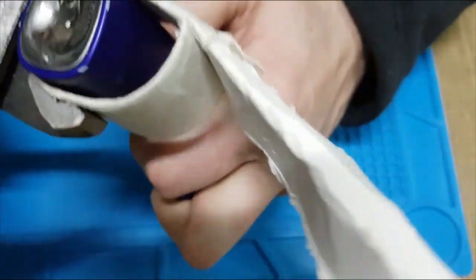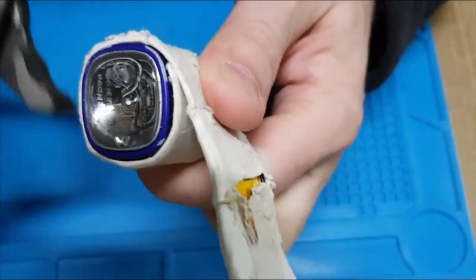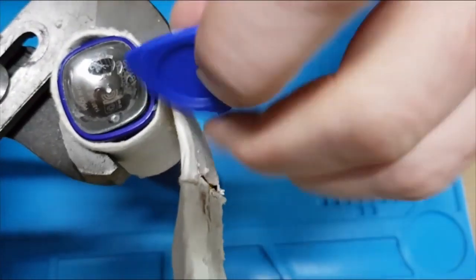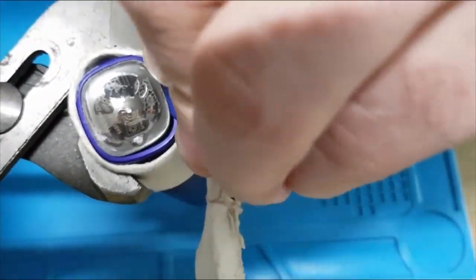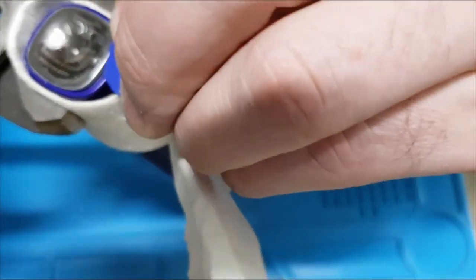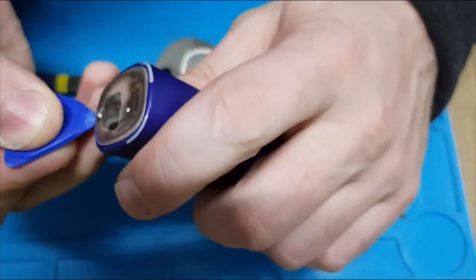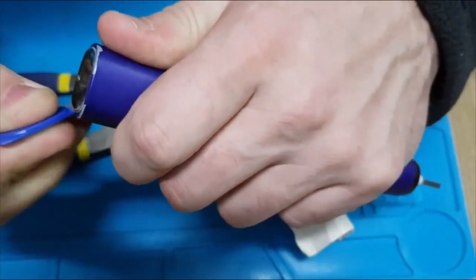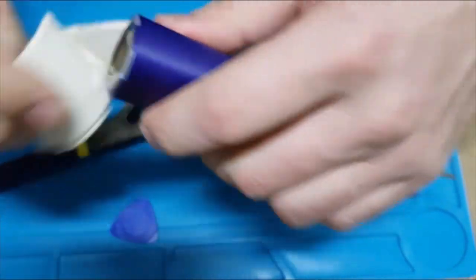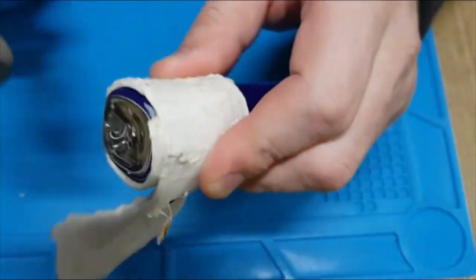So let's try it one more time. Press it, insert the spacer into the side of it, and press it on the sides. And this side already pops out. Pop it out, and we can go around it and open another side.